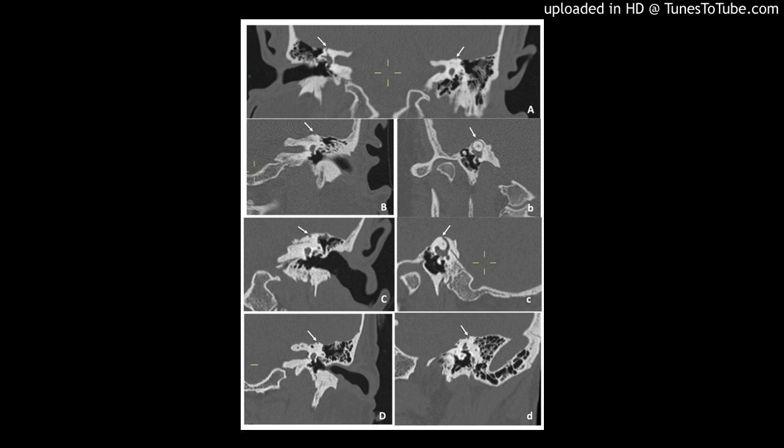Figure 4. The approach to the superior semicircular canal obliteration in a right ear. The star shows the antrum, the X shows the skeletonized, but not exposed, middle fossa dura. The white arrow points to the anterior aspect of the superior and the dashed white arrow to the anterior aspect of the lateral semicircular canal. The root of the superior and the lateral canals are highlighted with a dotted and dashed line, respectively.